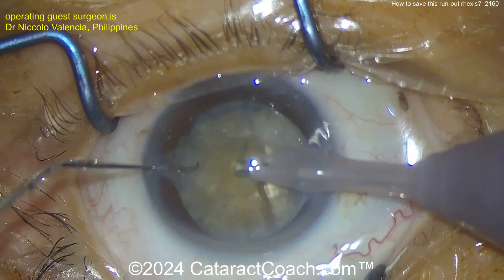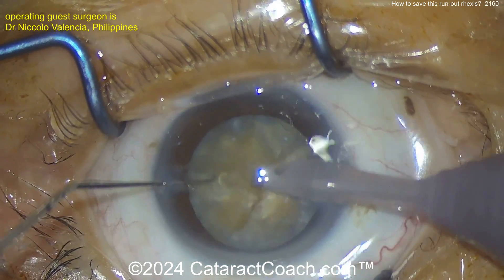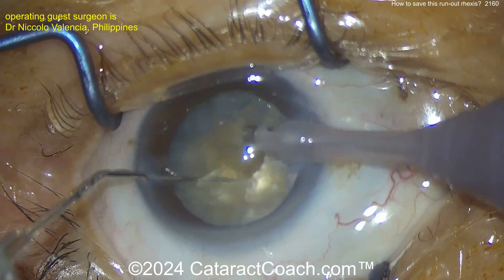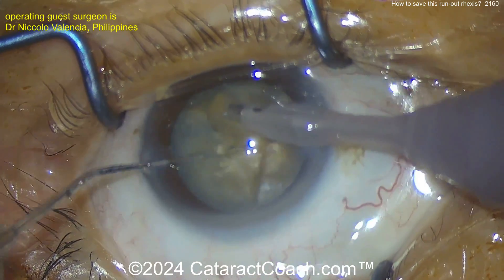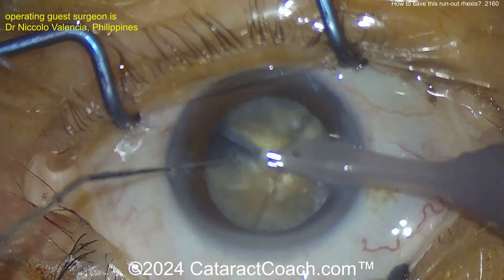How come it rotates so easily even though you didn't do hydrodissection? Well, in these white cataracts with the intumescent lens, that liquefied stuff is the lens cortex — it's already liquefied, so it's already naturally hydrodissected before you even get in the eye. You oftentimes really don't have to do any hydrodissection.